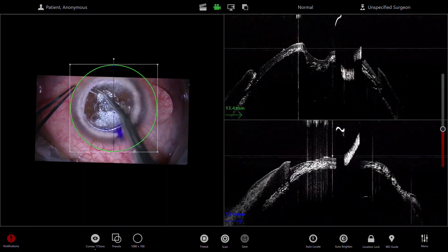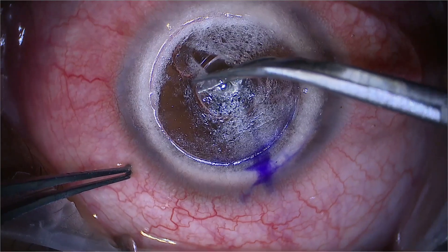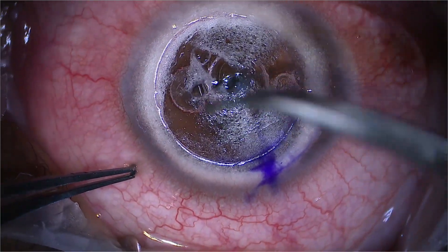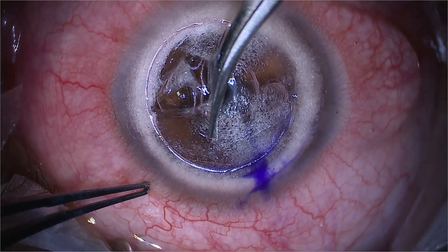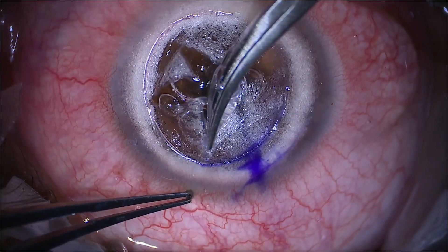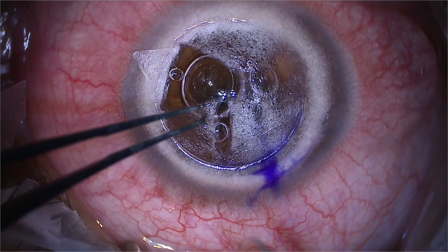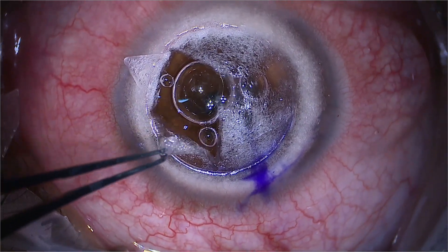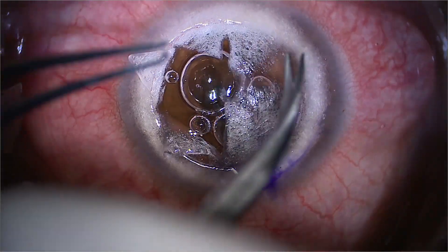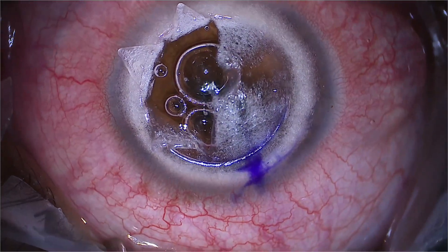Then I'm using the DALK scissors to create a quadrant — or a bit more than a quadrant — to remove each segment. I'm being very careful to cut upwards rather than downwards. With these DALK scissors, the lower half is longer than the upper half, so you could chop downwards but maintain the pressure upwards. Here I'm using the forceps very carefully to peel the quadrants back, trying to do a little petal to spread the remaining stroma outwards.